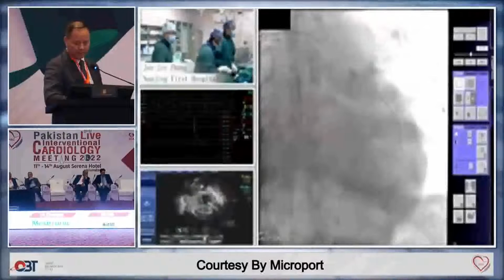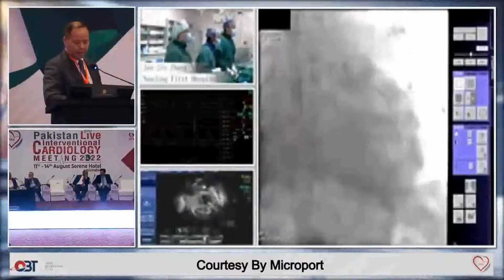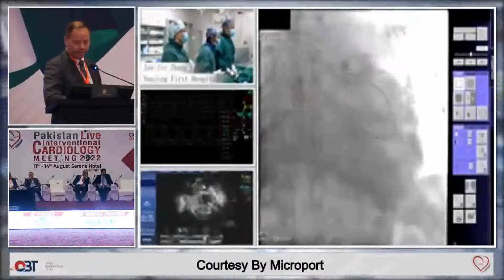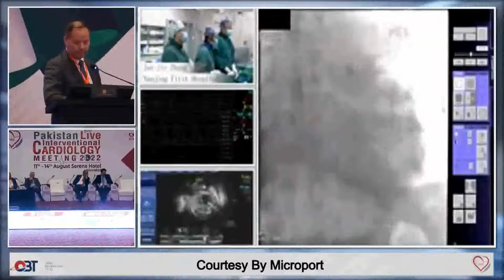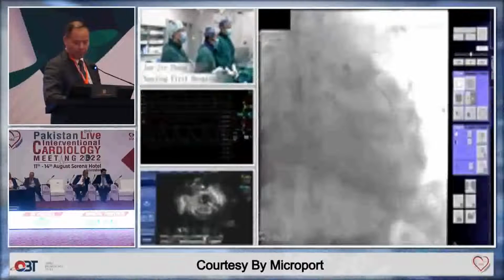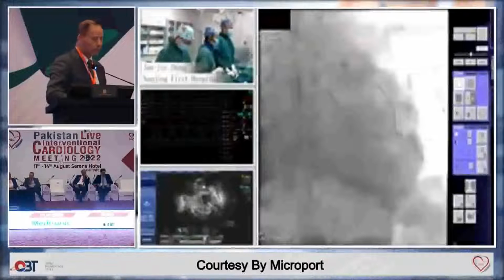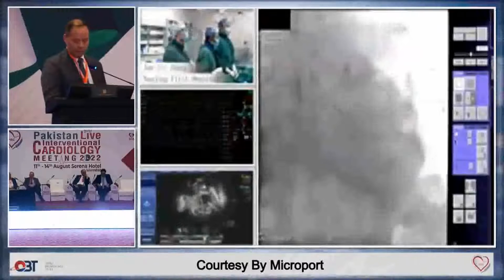Okay. So is there any concern about acute occlusion of the second branch of the pre-dilated obtuse marginal? Yeah, it is possible. That's why I put the wire to protect the distal third. And from the IVUS, the lesion at the distal third is very focal, so I think the risk will be low, and also the angle is quite large. So I would only use the wire to protect the circumflex.